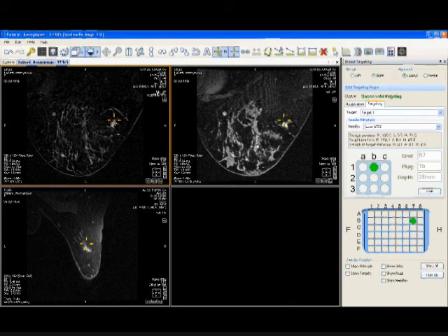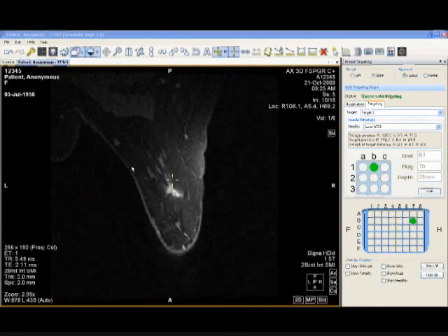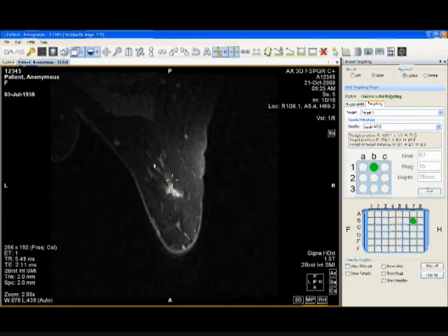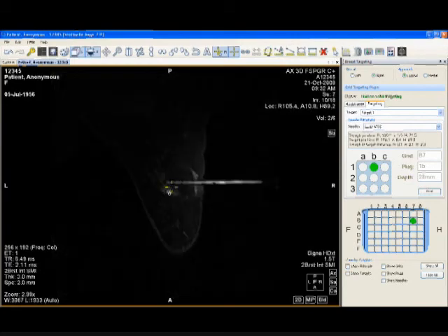There, now you see the obturator in place, again here, and if you watch in the axial plane, you can see pre to post obturator, you can see that there is some tenting of the tissue. If we have it centered on the tissue before versus after, you can see it has in fact moved. I did advance it slightly more than indicated, and now the obturator is centered pretty much on the lesion. At this point, we performed a series of biopsies.